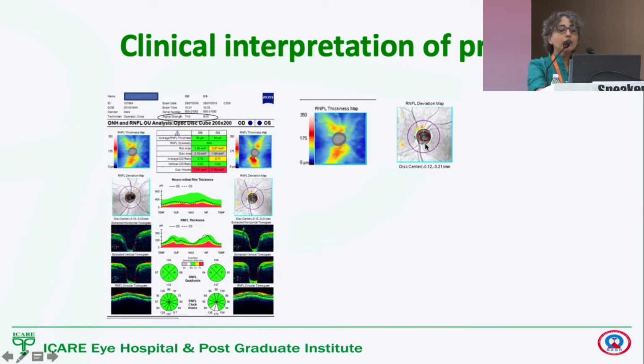Now this will tell you the deviation from normative data. Now please remember that the normative data in these machines is limited. There are a couple of thousands of patient data ranging ages, sexes, different nationalities or geographical regions, and they take a normative data and compare what your patient data is to that normative data, and according to the percentile range, make it green, orange, yellow or red.